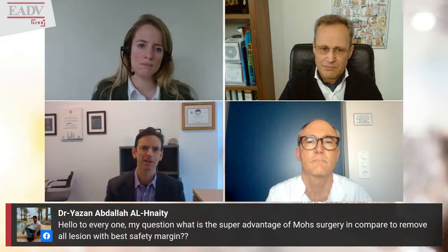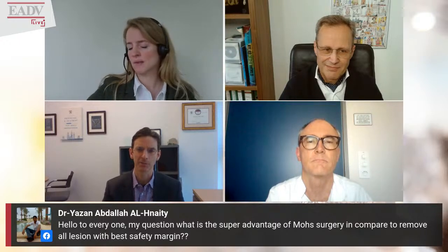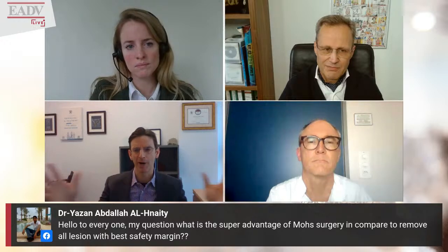And Kai, the example you showed on the chin earlier today was a very nice one of how if you used a cookie cutter template, you would not have likely achieved a clear margin on that. You mapped that tumor in both its breadth, how wide to cut, and its depth, how deep to cut, and the microscopic directed excision is the super advantage. You knew where you needed to go.